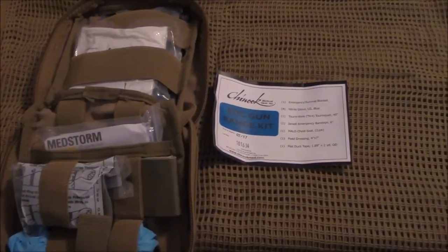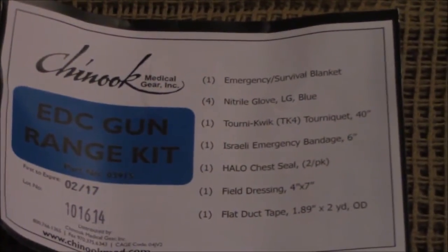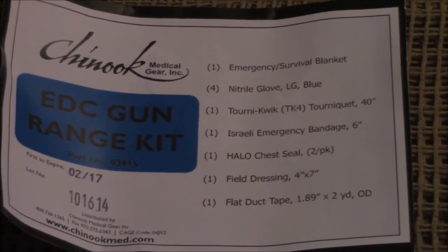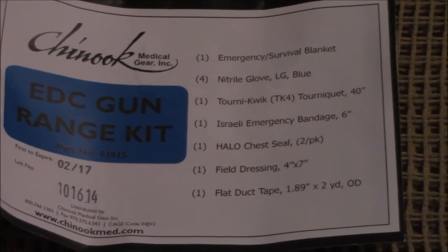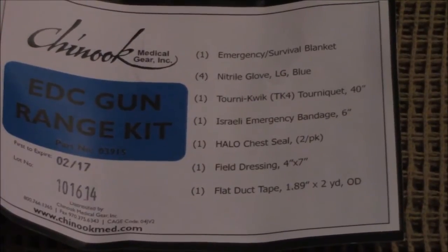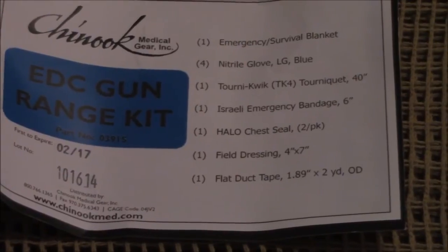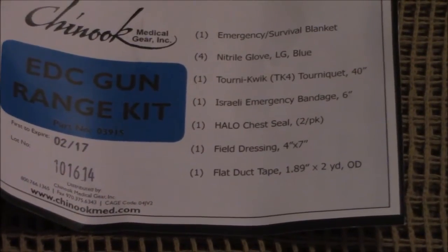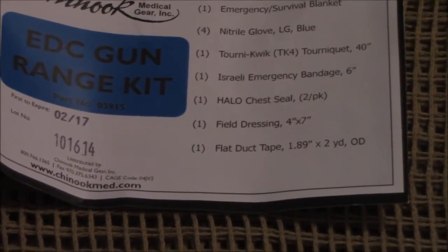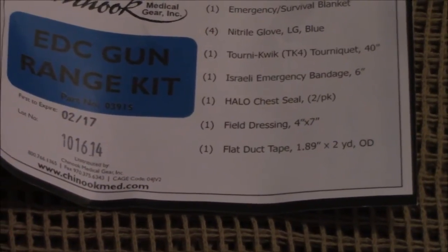So we've got the kit open. Inside you have one emergency survival blanket to keep the patient or yourself warm. You've got four large gloves for PPE purposes, one TK4 tourniquet, one Israeli emergency bandage six-inch, one halo chest seal which comes two seals per pack, one field dressing four-by-seven, and flat duct tape — 1.89 inches by two yards, OD green.